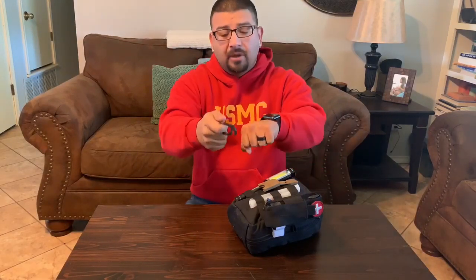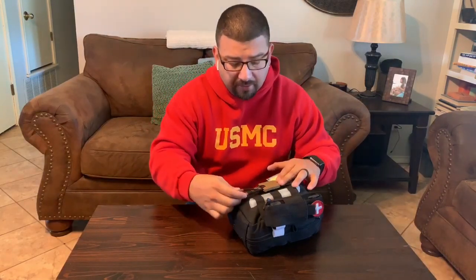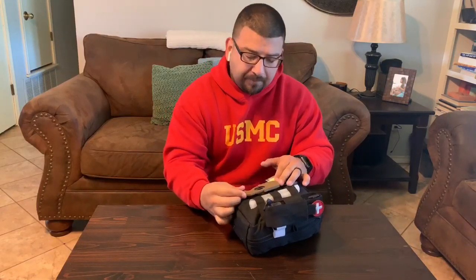Another thing that this thing works really good for is t-shirts. If you have somebody that has a stab wound, a gunshot wound, stuff like that, and their shirt's in the way, I can grab the collar, slice down, and open up their shirt, and we can get to the wound a little bit quicker. Now, I'm not 100% sure if this will work on denim. I'm assuming it will, just because of how strong it is and how easy it goes through seatbelts, but I have not tried that yet.